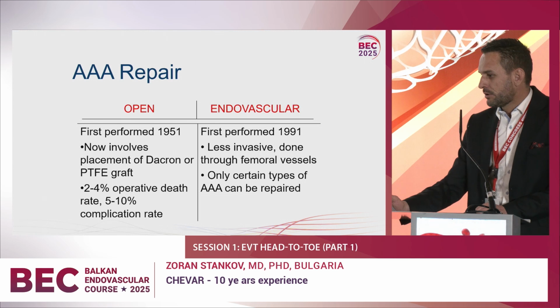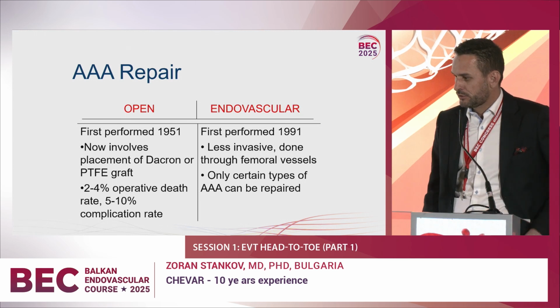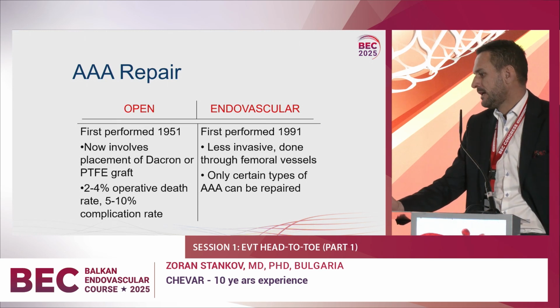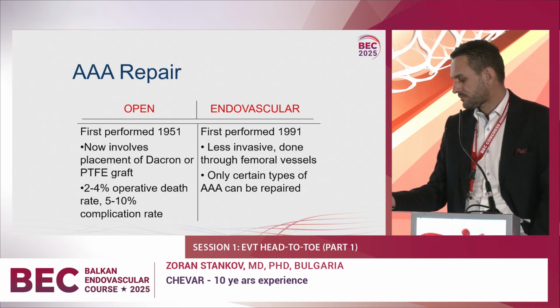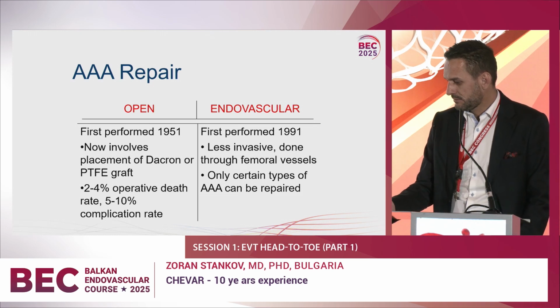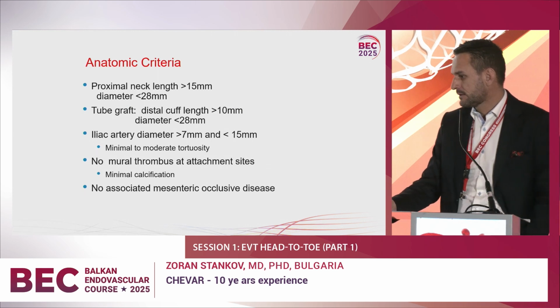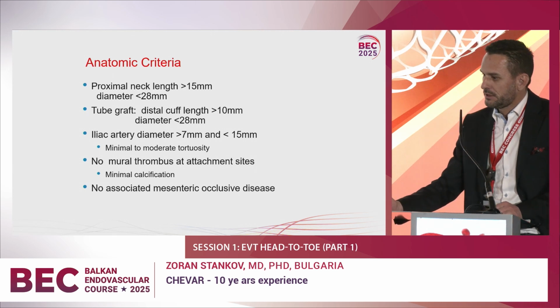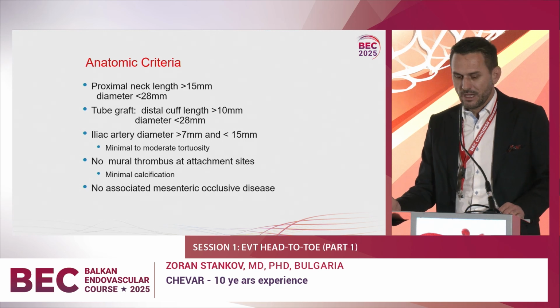Before, we were talking about what is better, open or endovascular strategy for the abdominal aortic aneurysm. Now everything is clear. Endovascular treatment is a standard procedure for vascular surgery and for endovascular specialists. These are the criteria necessary to implant an endovascular stent graft for abdominal aortic aneurysm.